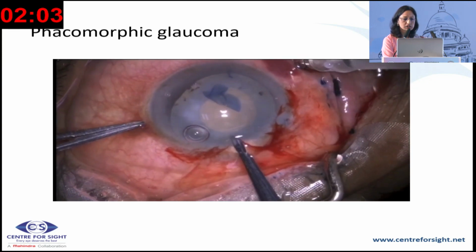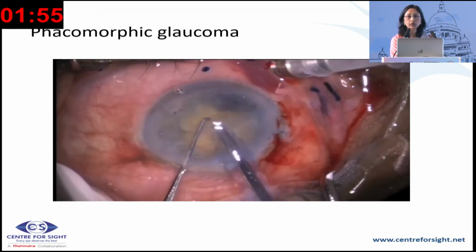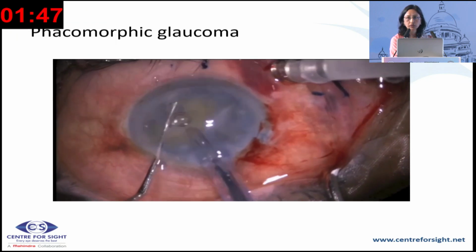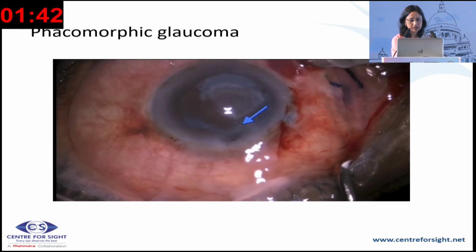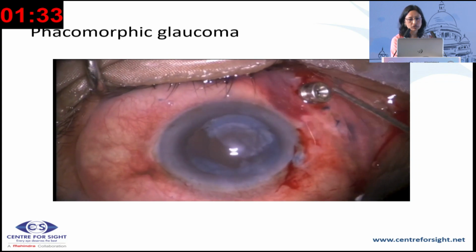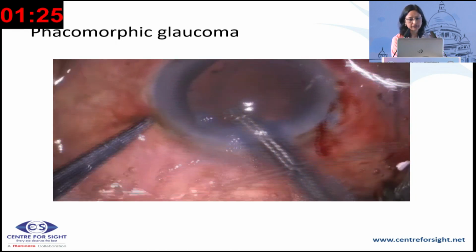Now, most of these patients have areas of zonular weakness in the periphery. So when we are using fluid and doing the phacoemulsification, the fluid might misdirect posteriorly, causing acute fluid misdirection syndrome. Sometimes in the middle of the surgery you get high pressures and iris prolapse, like happened in this case. You can see that the iris is prolapsing through the wound, and again the pressures are high. So we again remove the plug, remove whatever extra fluid is there, and it instantly lowers the pressure and deepens the AC, and the rest of the procedure can be completed safely.